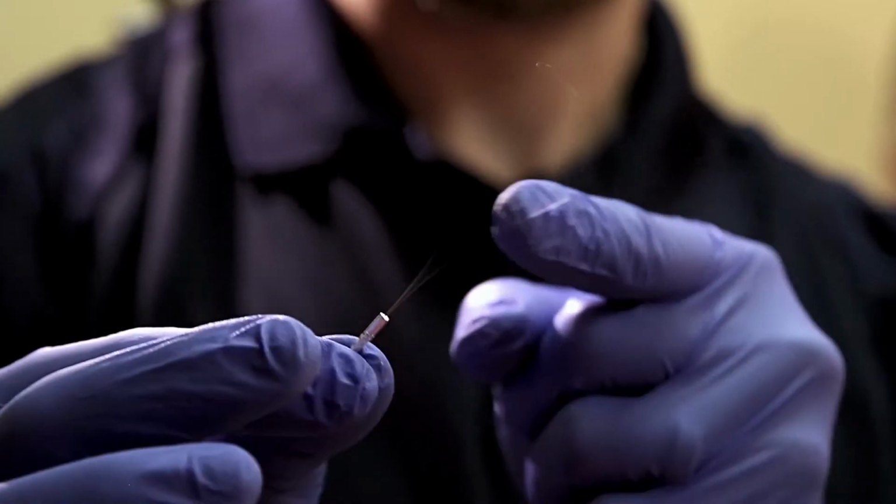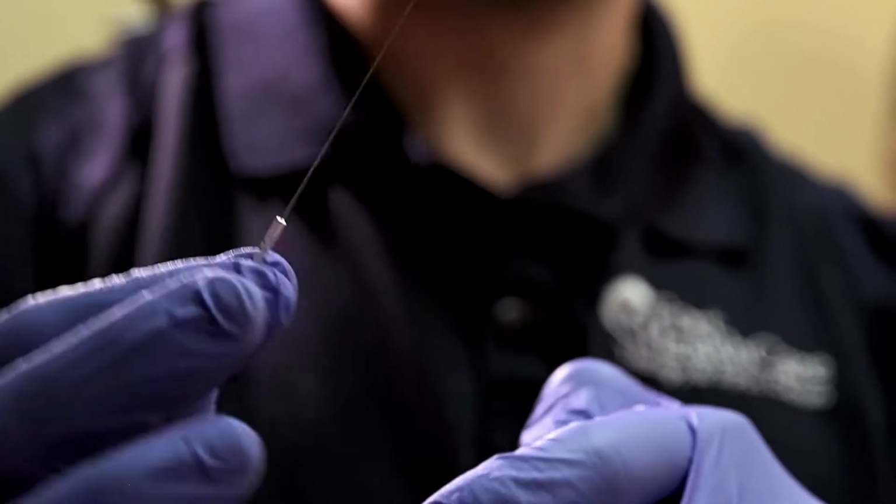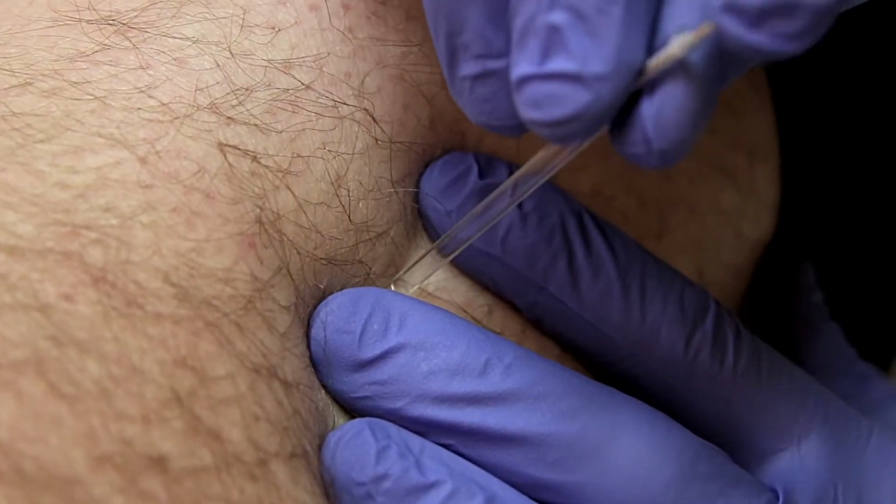Once the needle is inserted, we have to remember it's 1/16 the size of what you get a flu shot with. So it goes in very easy, it's very thin, it penetrates tissue very smoothly. The treatment itself will take merely minutes. It takes longer to identify the tissues, and the needles themselves are in for just seconds.